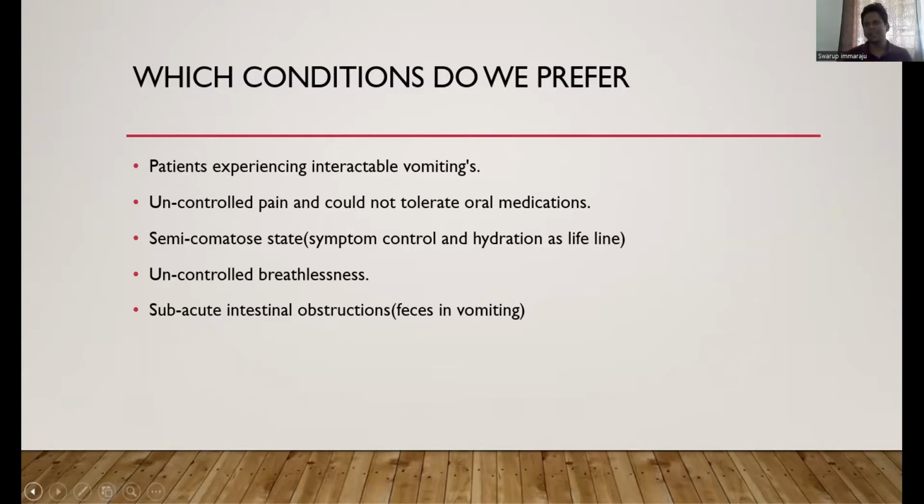When the patient is at the end of life, but on the other side we feel that the patient is dehydrated, if that is the situation, go for the subcutaneous infusion, and hydration can also be given. A 500 ml infusion can be given over approximately 12 to 18 hours, very slowly, regulate it well.